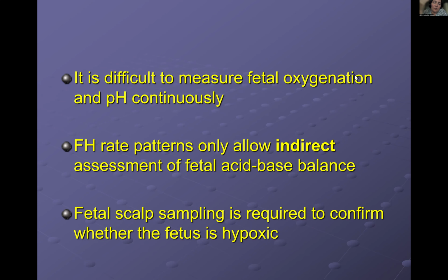And that's certainly not something that you're going to do before the fetal scalp is visible, that is, before the complete engagement and imminent delivery. And you can't keep on nicking the fetal scalp just to take oxygen because it's causing trauma.